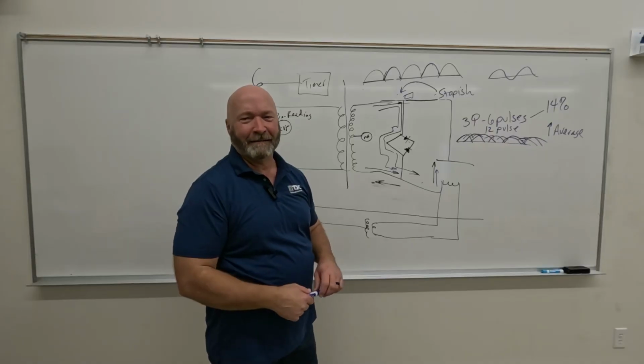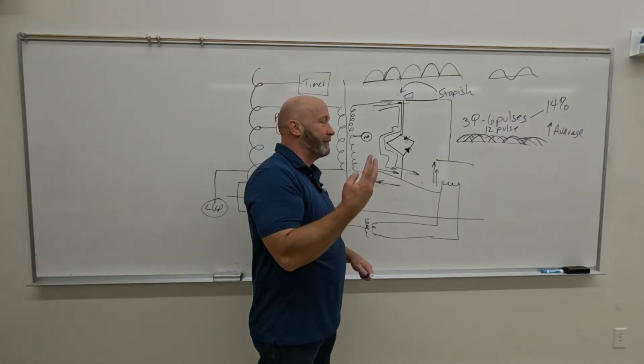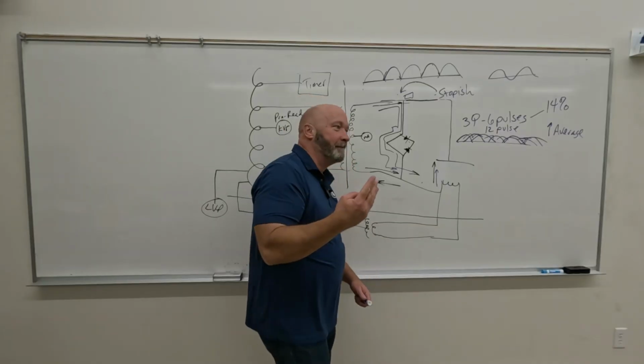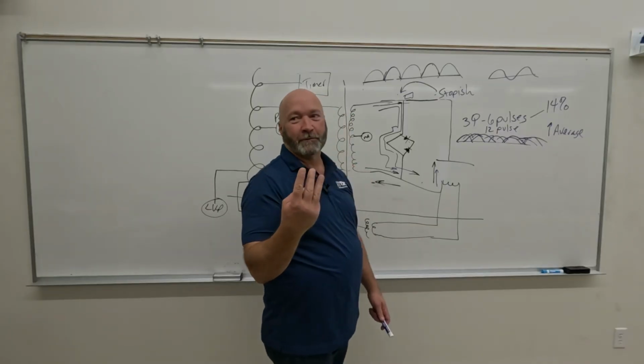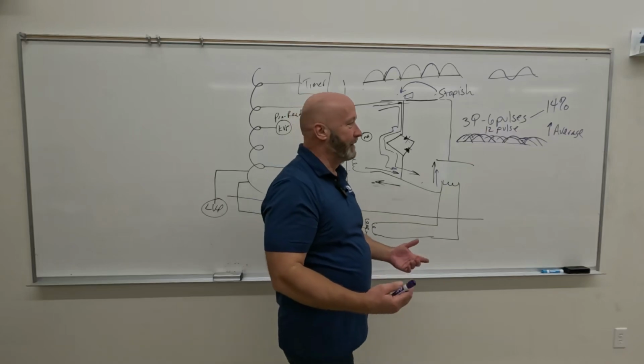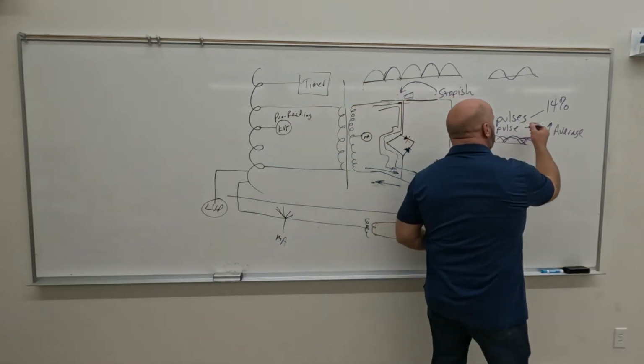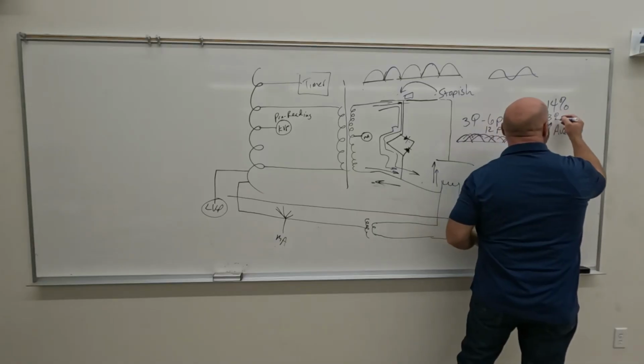Yeah, I agree. It's like 3 phase times 2 equals 12, whatever. Okay, but we can do it. And once that happens, then the voltage ripple drops to 3%.